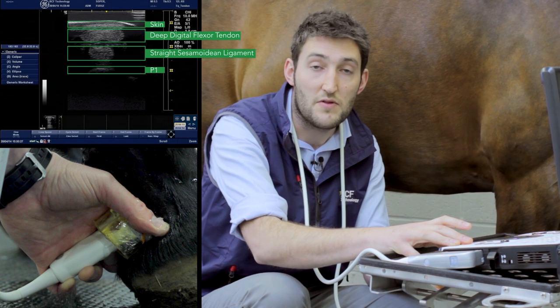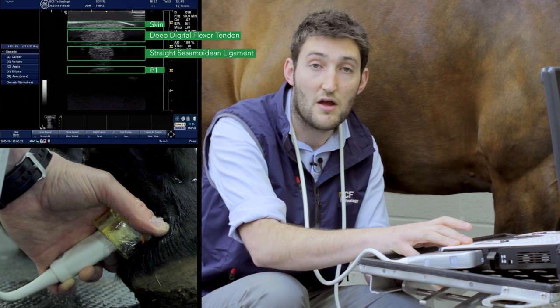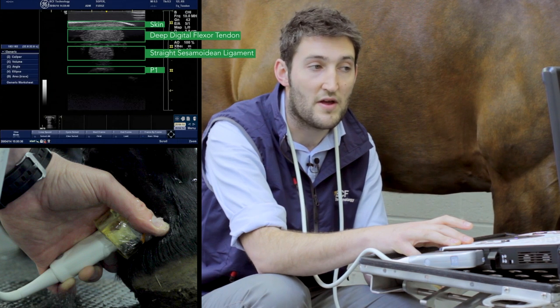The angle that you hold the probe is quite important, because you can otherwise create artificial hypoechoic areas that would mimic a core lesion within that structure.